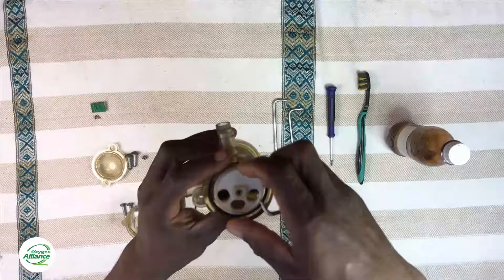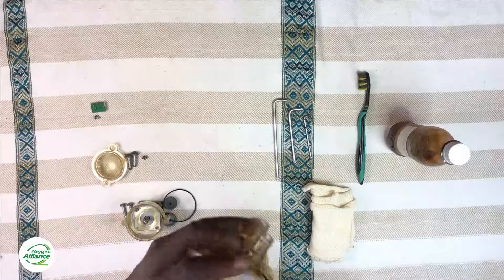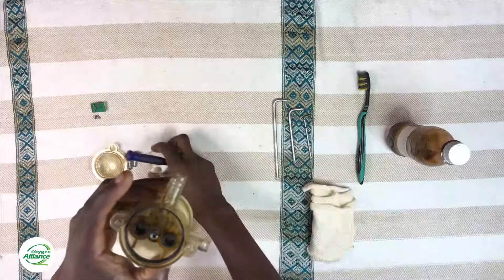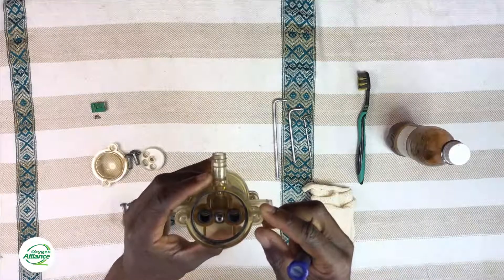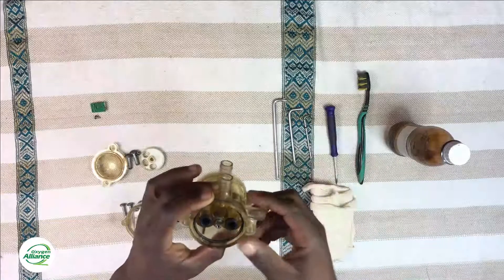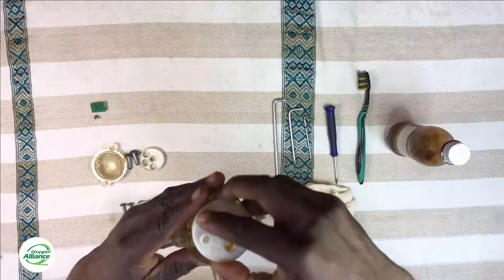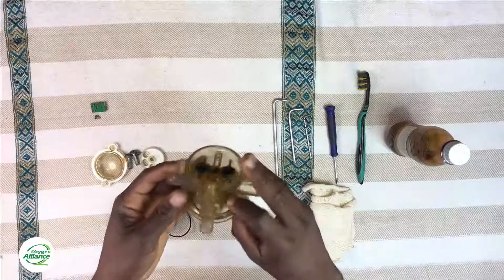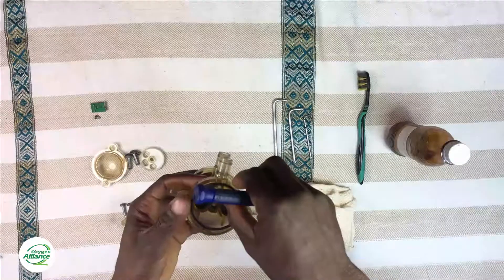Once the screw comes off, remove the three-hole disc using a small flat screwdriver — you might need to use a little bit of force here. Once you push it up a couple of times it comes off nicely, and you can now see inside where we have the three channels of air: two of them are the feed ports and one is the exhaust port. After that, push on the small rod in the middle of the valve and that pushes out the one-hole disc on the other side — the rod is connected to the one-hole disc so it comes off as one piece. You also have an o-ring on the other side, which you can push out with the flat screwdriver if it doesn't come out on its own.